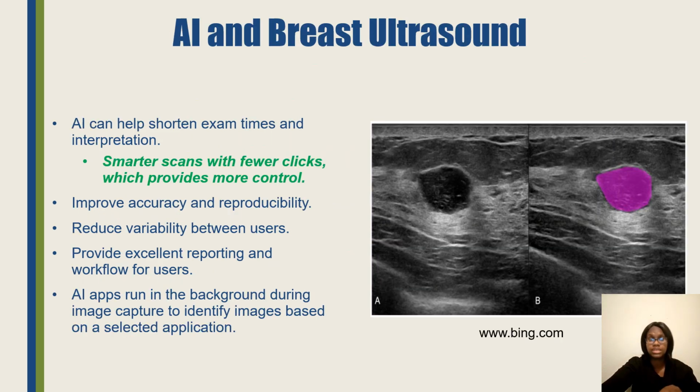This is a breast ultrasound scan if you haven't seen one before, but it can help shorten the exam times and improve how accurate the lesion that was detected, especially if you have a technologist who is working or training that isn't comfortable, because sometimes it takes a lot of repetition to get comfortable with performing breast ultrasound. That's why the technologist who is doing it should be well trained and comfortable just so nothing get misdiagnosed, or make sure if a lesion is in the breast that it get found.